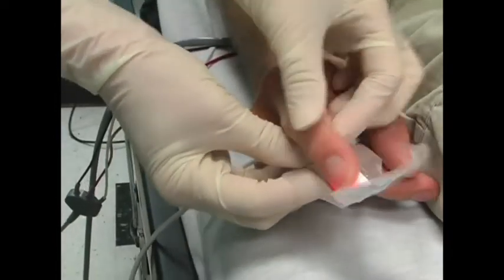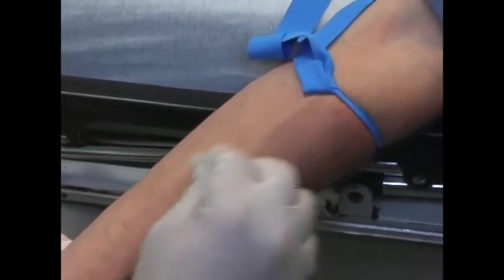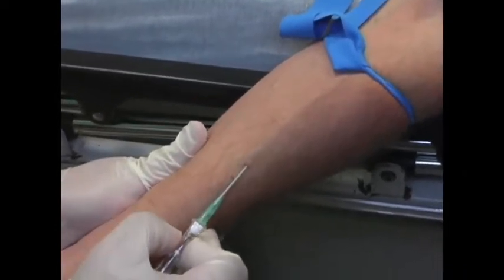Vital signs must be monitored, and pulse oximetry should be used throughout the procedure. Intravenous access is typically utilized for drug administration, unless conditions allow for intubation without the use of IV drugs.